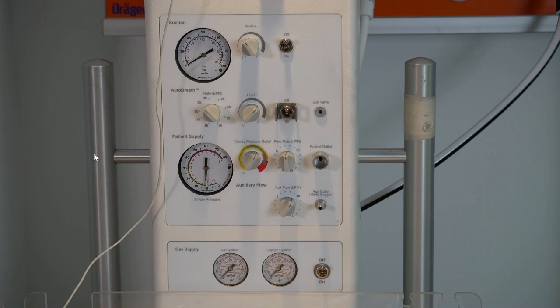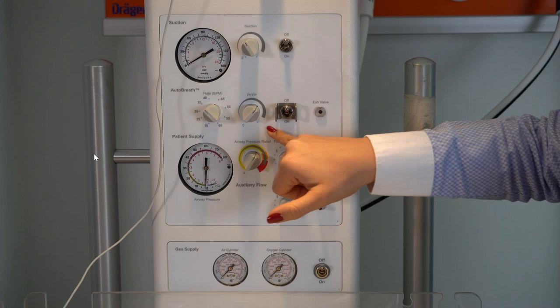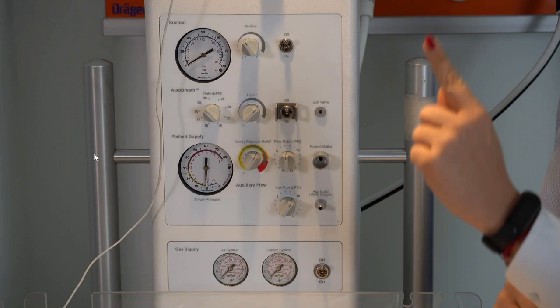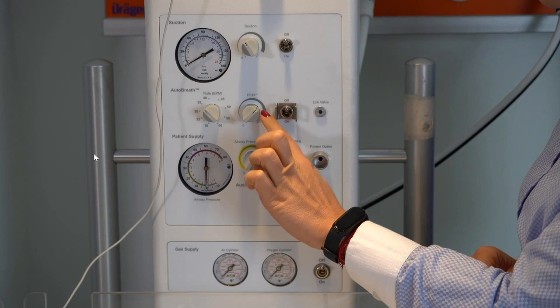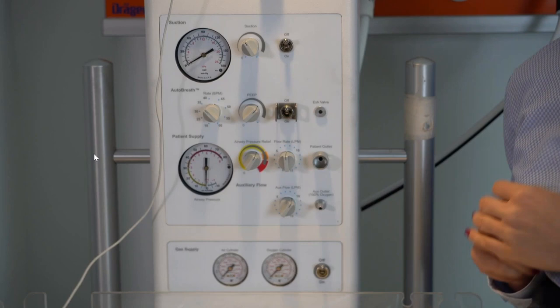Excellent, thank you. So the next question: can you show us how to set the PEEP level with the auto breath? It's actually quite simple. So you have the PEEP level setting here. And again, we do recommend to start at the setting of 1 or 1 o'clock. There is a little mark here which indicates the recommended settings, and then based on the patient, you can adjust. But the starting point is the little mark on top, and that would be our recommended setting for the PEEP level.